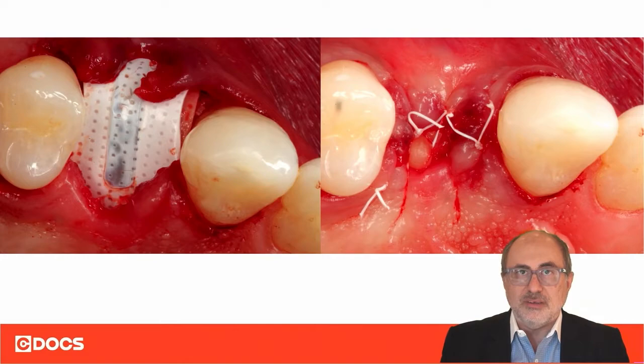And then on top of that, we place a titanium-reinforced PTFE membrane that will then act as our secondary membrane. So, if we have to remove that secondary non-resorbable membrane earlier — if it becomes exposed or we leave it exposed — we can, and we still have the underlying long-resorbing membrane, Os6 Plus in this case, to act as a buffer to regenerate the bone.